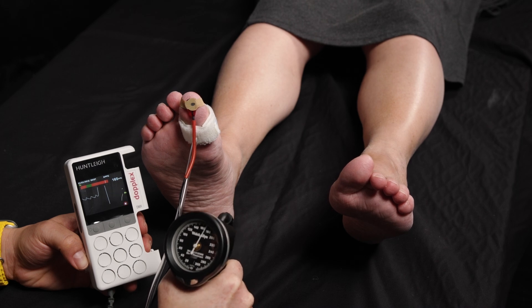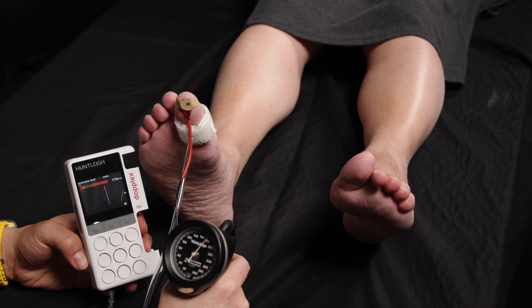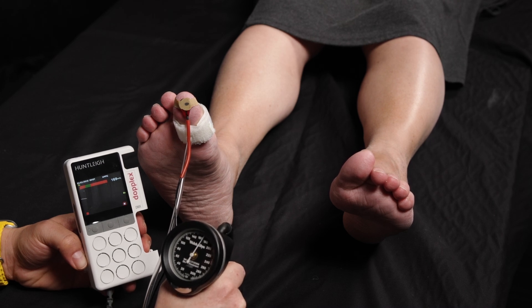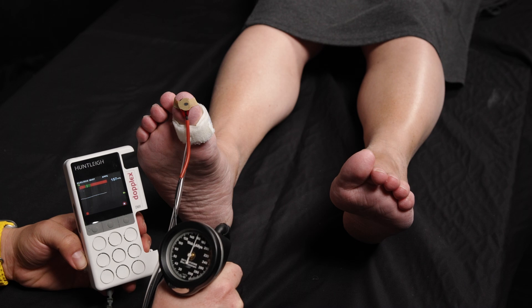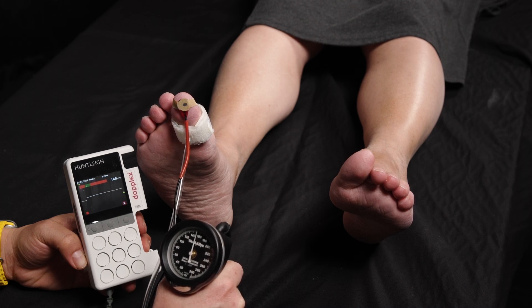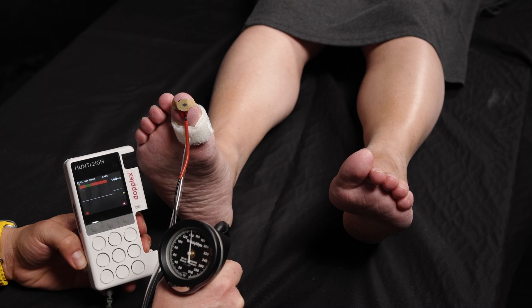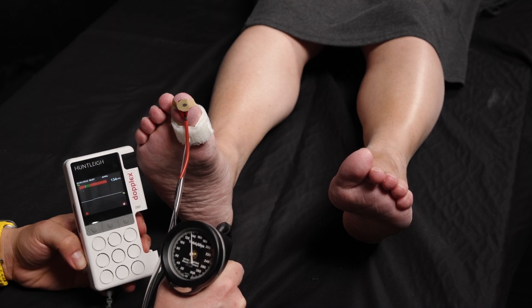Just be cautious of over-inflating — it's only a small cuff and it doesn't need a lot. Then I'm going to deflate at a steady rate. What I'm looking for is the first regular blip. The point at which the blood can overcome the pressure of the cuff is where we say the toe pressure is.